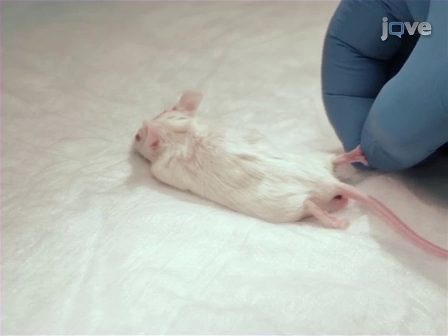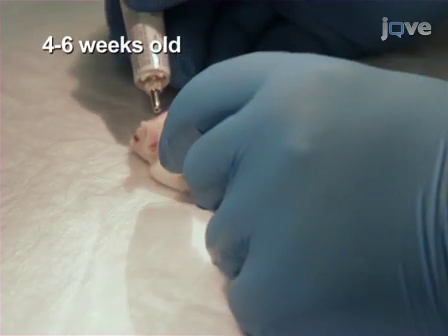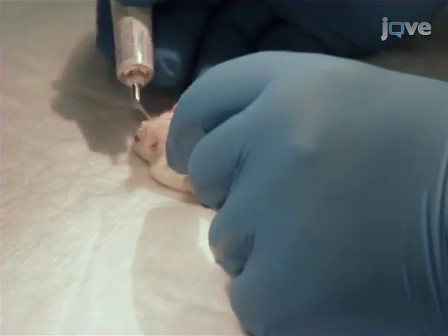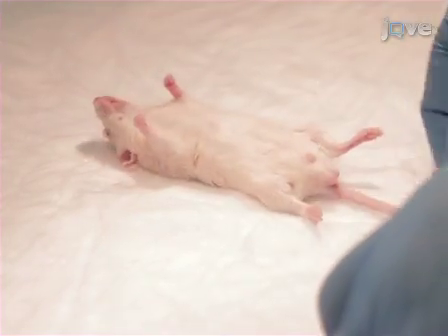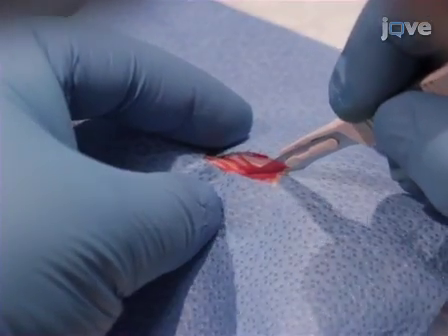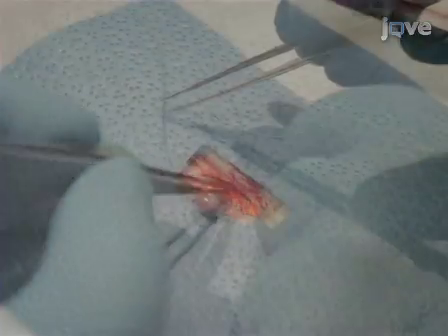To establish sepsis, after anesthetizing a mouse with an intramuscular injection of 75 mg per kilogram of ketamine and 20 mg per kilogram of xylazine, and using a toe pinch to check its level of sedation, place the mouse in a supine position. Clean the abdomen, then make a 15 mm midline incision to expose the cecum.